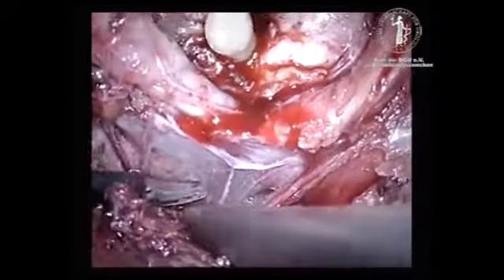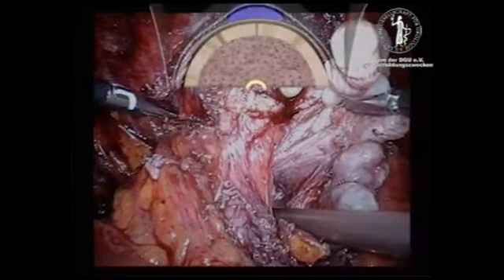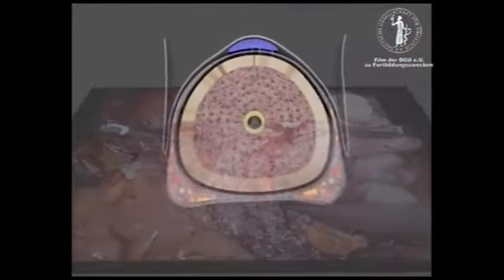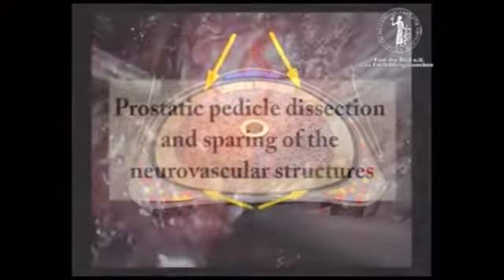At this point of the procedure, the shining surface of the prostatic capsule is clearly seen medially and laterally. As shown in the diagram, during the initial fascial incision ventrolaterally, as well as during the blunt dissection of Denonvillier's fascia, two planes are created to guide intrafascial nerve sparing.